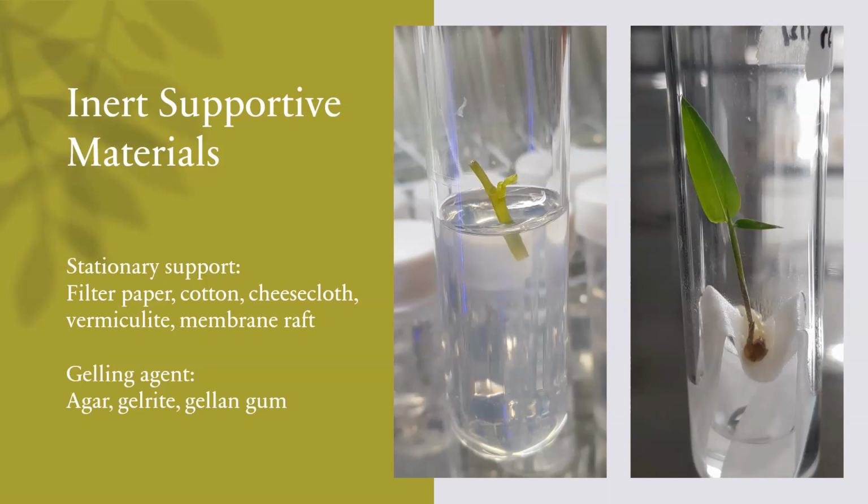These gelling agents form clear gels, unlike agar, which is translucent, and hence it is easier to detect contamination, which might develop during culture growth. Their prices are twice that of purified agar, but only less than half as much gel-rite or gellan gum is necessary to provide the same gel strength.